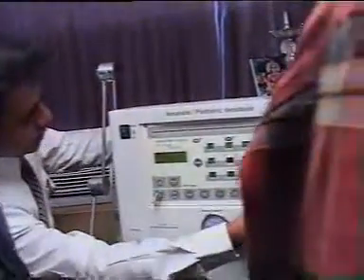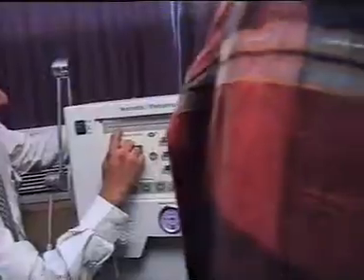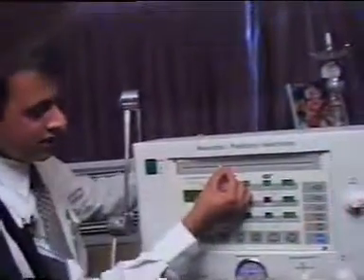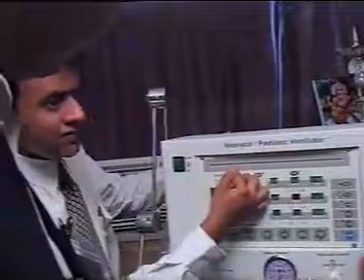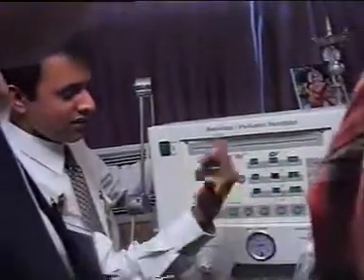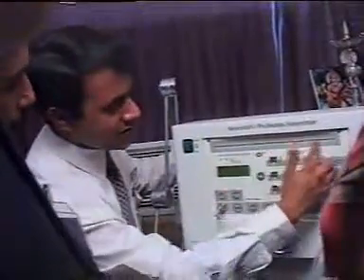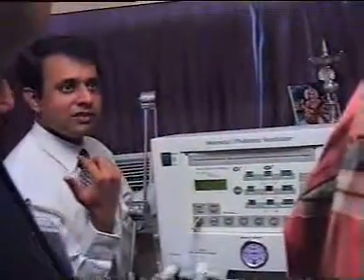So PIP and PEEP knobs are to be set, and this is how it's shown. The zero level is over here. You must always have 2, 4, or 6 showing. What does that say? Very good, that the PEEP is always there. And if there is a negative deflection, you will get it with each breath. When the trigger is activated, you will have the negative deflection, and subsequently the PIP which is delivered to the baby. I think that is good enough. And this is the humidifier, with temperature control.